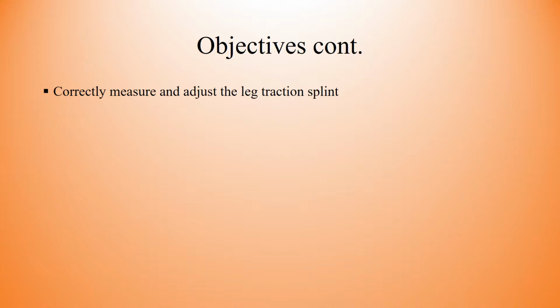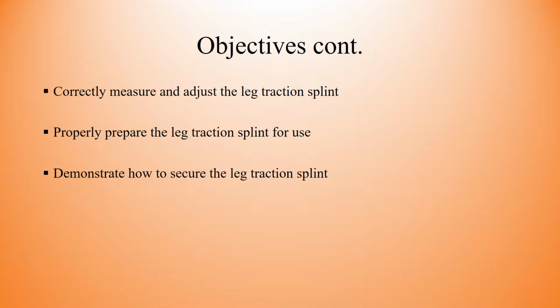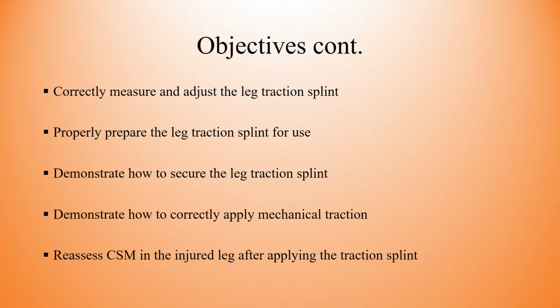Correctly measure and adjust the traction splint. Properly prepare the traction splint for use. Demonstrate how to secure the leg traction splint. Demonstrate how to correctly apply mechanical traction. And finally, reassess CSM in the injured leg after applying the traction splint.